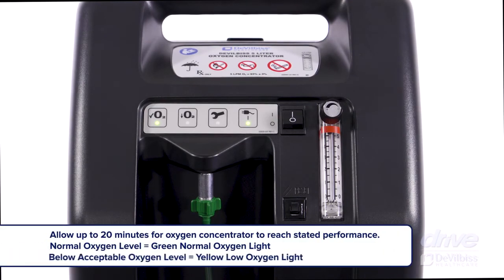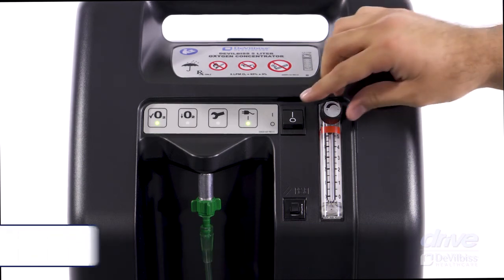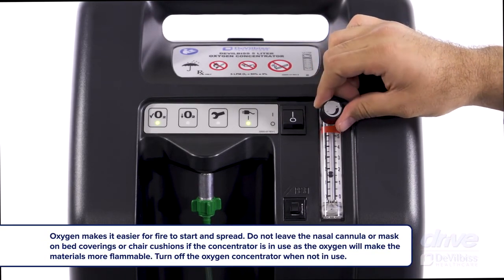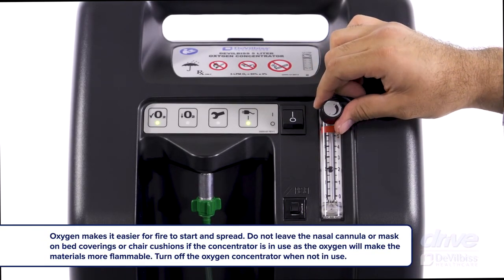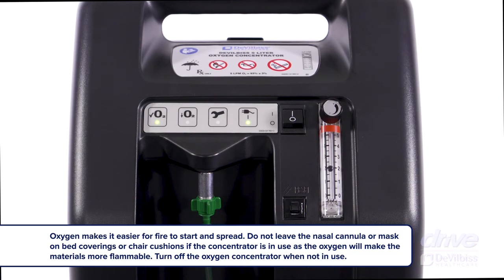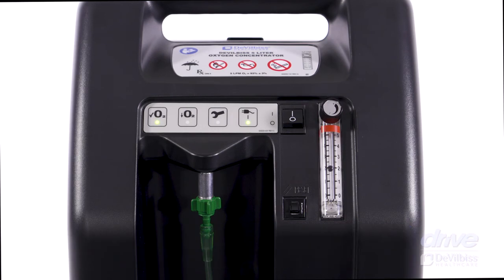After a few seconds to a few minutes, depending on your setting, and if you are operating the 5-liter or 10-liter unit, the normal oxygen light will illuminate and remain lit. Check the flow meter to make sure that the flow meter ball is centered on the line for your prescribed flow rate. Your equipment provider will do this during initial setup, but you should verify the setting each time you use your oxygen concentrator. Your Drive DeVilbiss Oxygen Concentrator is now ready for use.